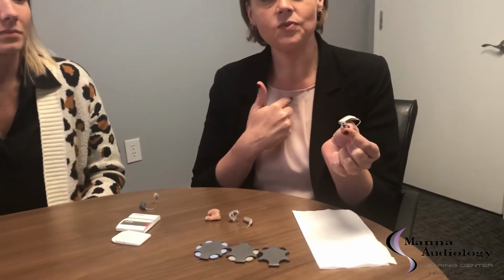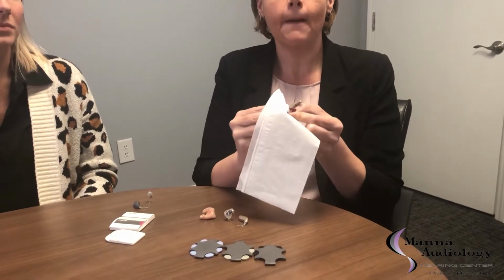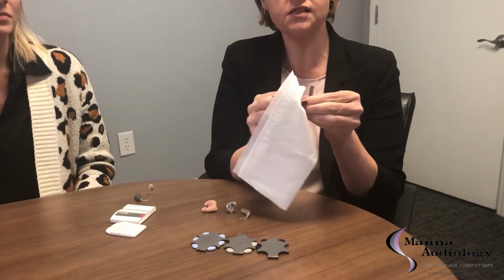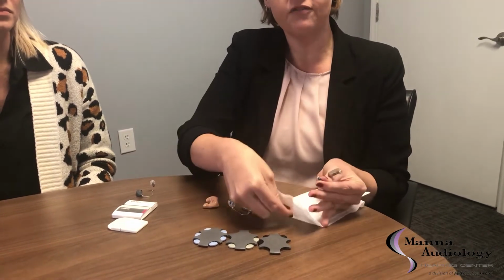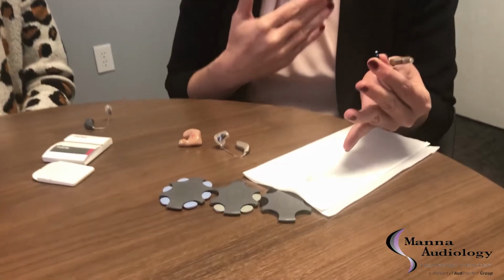So the first one that I'm going to start off with are from the manufacturer Oticon, and I'm going to start off with what they call the standard RIC, or the receiver in the canal instrument. Now, on the end of this guy, you have a little rubber dome. So the easiest way I think to pull that little rubber dome off is to take a tissue. You're going to pinch it between your fingers and then pull that guy off. The tissue is nice because it keeps the little rubber dome and you don't have to worry about losing it.